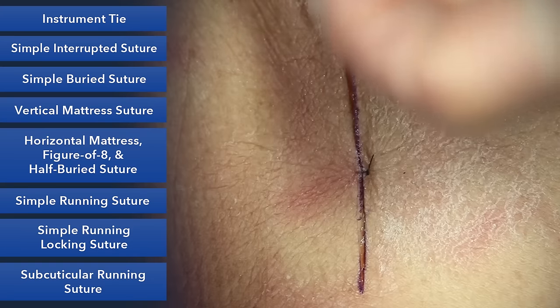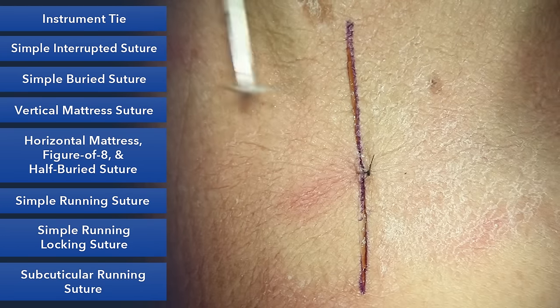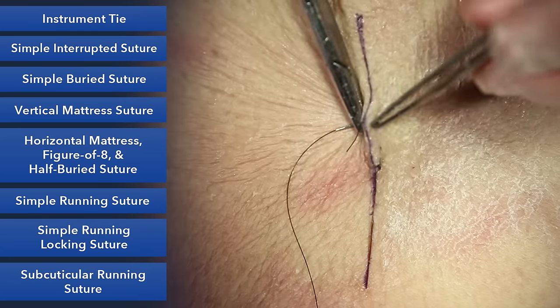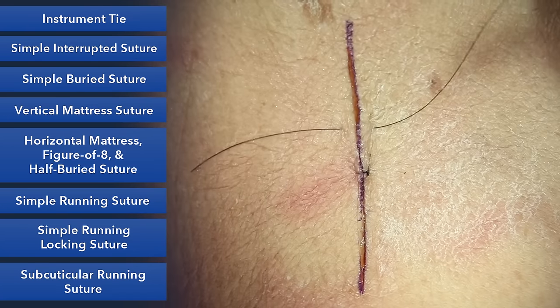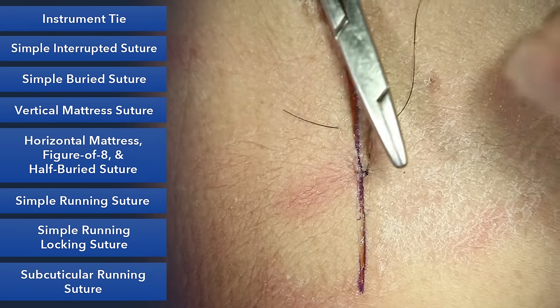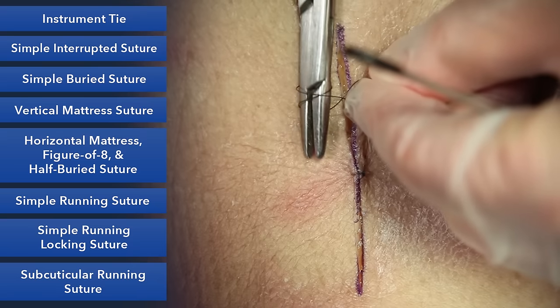Some suture material you may need 4 throws, something maybe like an absorbable suture. But this is a very basic technique. It allows you to suture in a small place. So if multiple people are working, and we'll do one more for you right here. You can suture. Notice I like to keep the short end very short. Your instrument doesn't move around very much then.